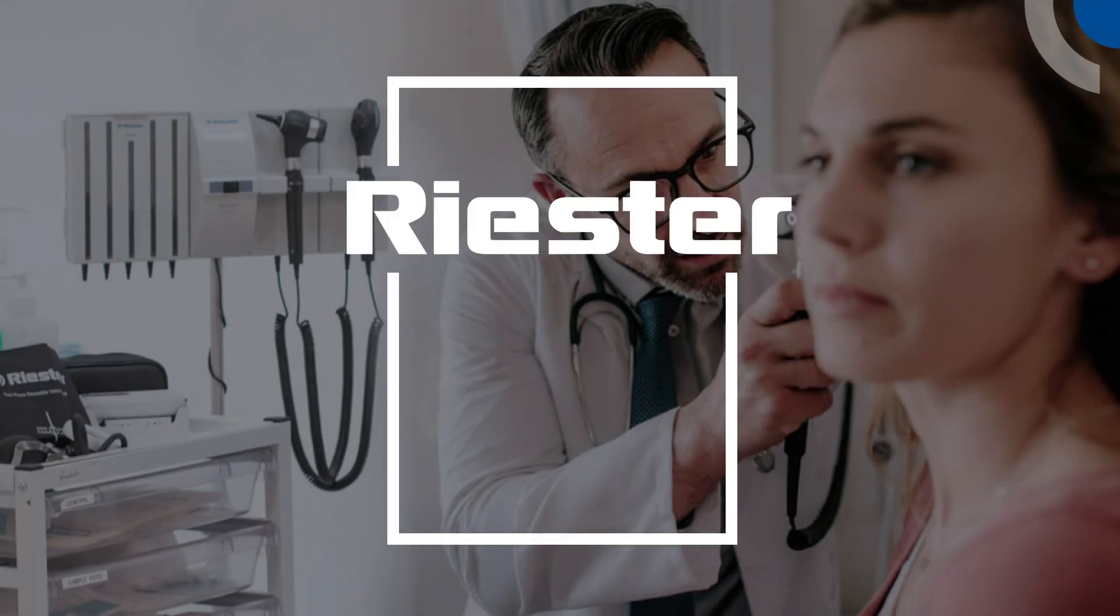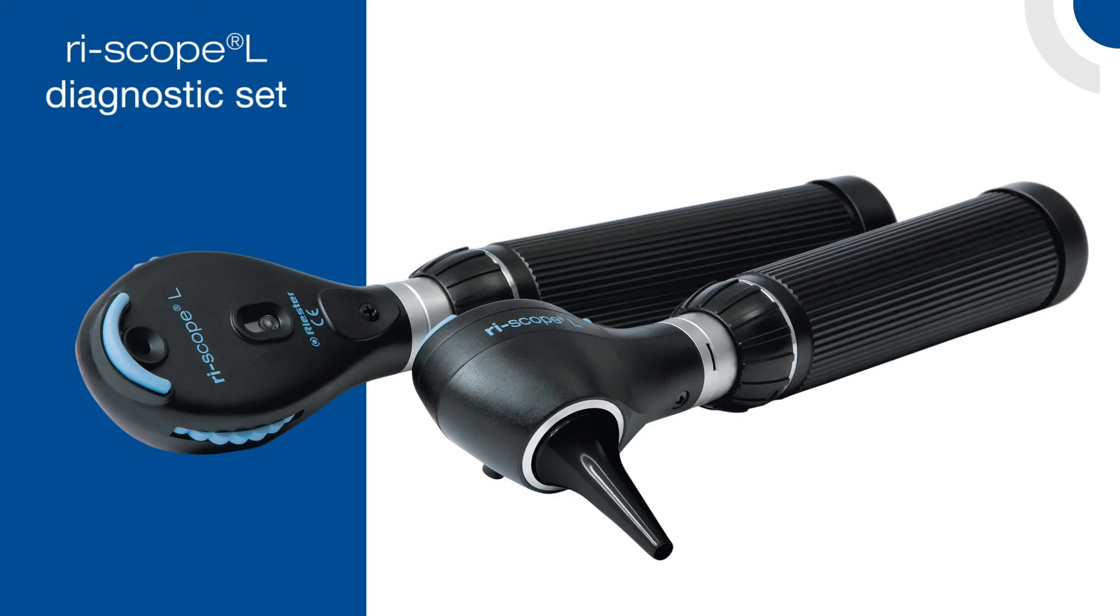Today we'll be unboxing the Reesta Diagnostics set which includes the Reescope L3 LED otoscope and the L2 LED coaxial ophthalmoscope.